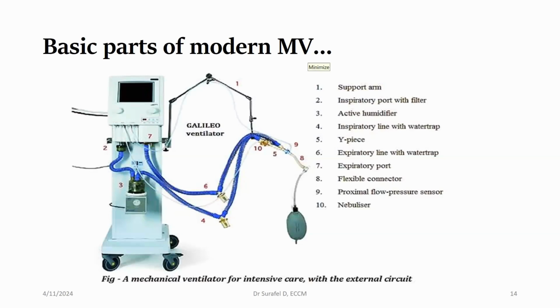So most of the modes and most of the troubleshooting we discuss from here on, we'll focus on the Mindray and the Philips. Actually, it doesn't change the basic idea of the mechanical ventilator. If you understand the basics, then you won't have any problem dealing with any of the machines. So you just need to revise the manual that you are using.